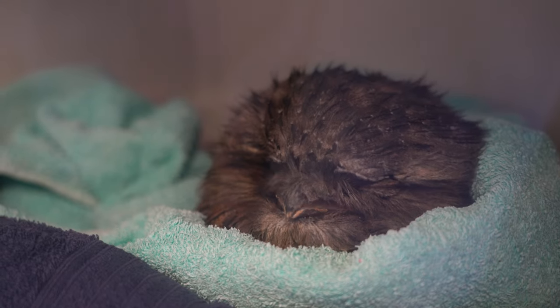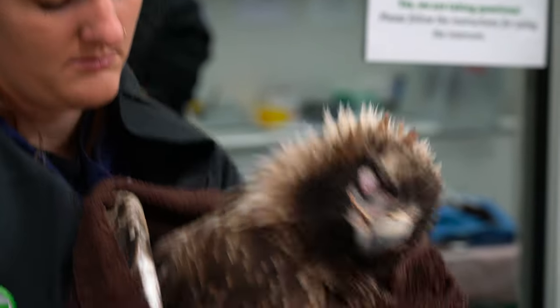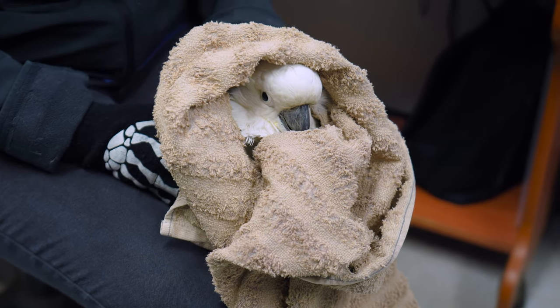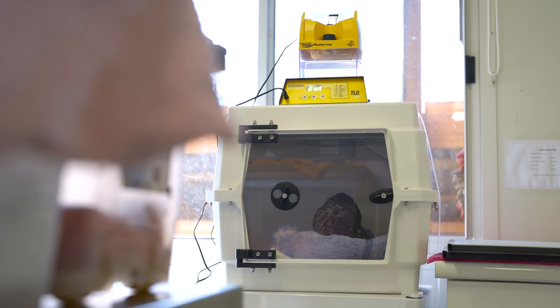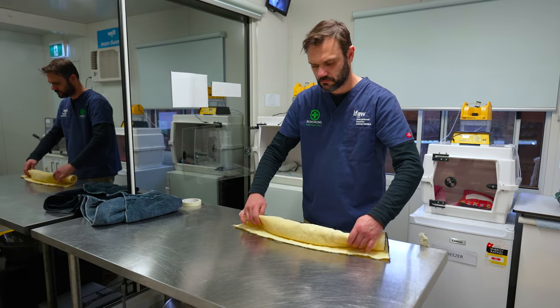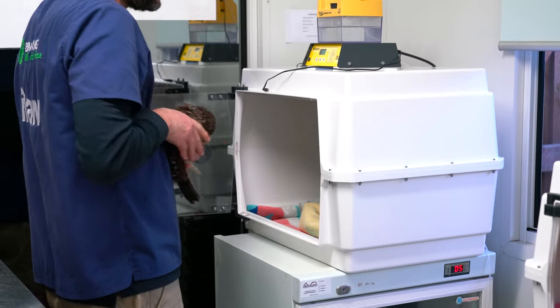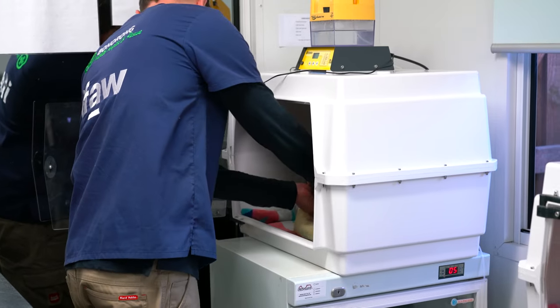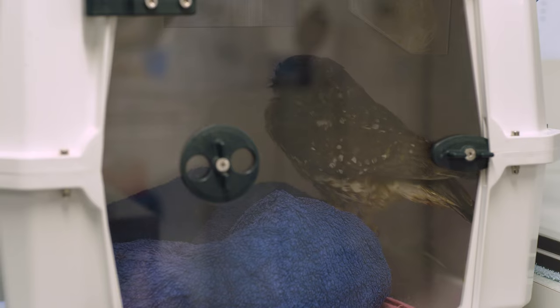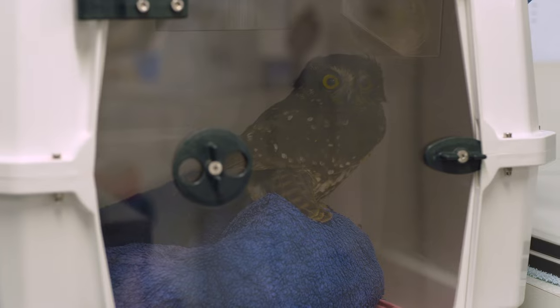When the animal is recovering from anesthesia and starts moving its head and becoming alert, we recover them in a warm environment such as a humidity crib. We place them in a donut towel with the keel resting on the towel inside the humidity crib, and leave them there until they are bright and alert for five to ten minutes. Then they are ready to go back to the enclosure where they are being housed.